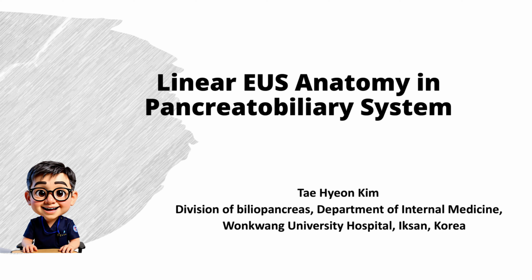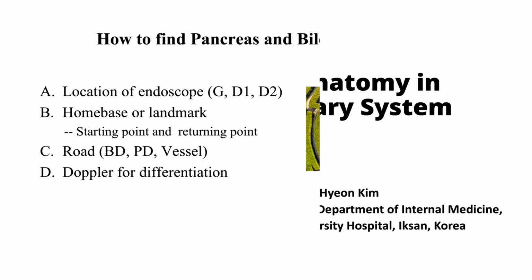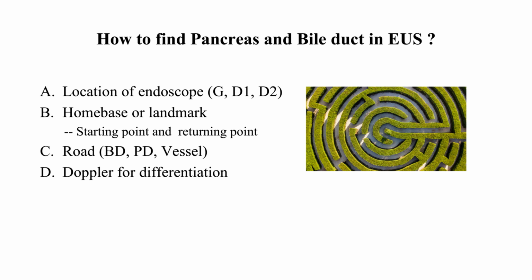Hello everyone, my name is Taehyun Kim, and today I will talk about the linear endoscopic ultrasound anatomy of the pancreatobiliary system. How do we find the pancreas and bile duct during EUS? I like to think of it in 4 steps.